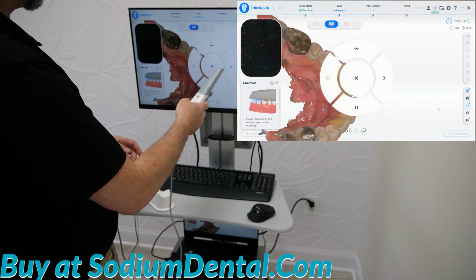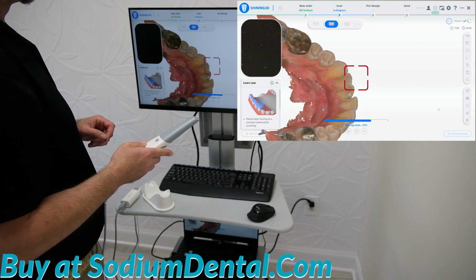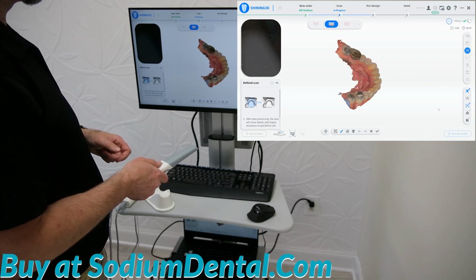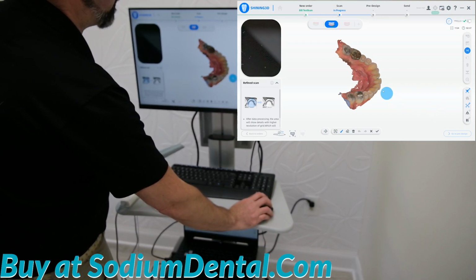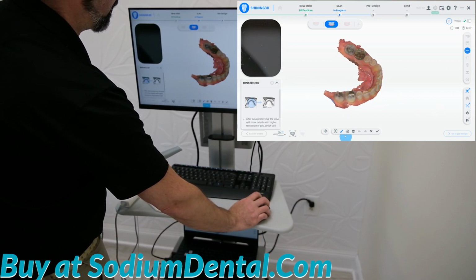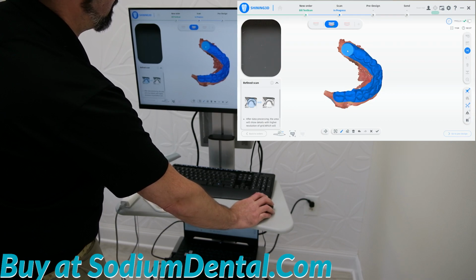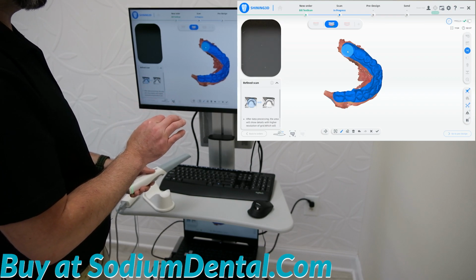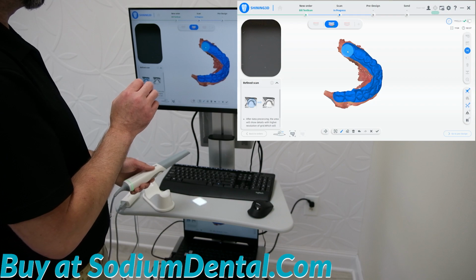Scanning is complete. I double click and wave my wand to the right to go on to the next arch. At this point, if we intend to use this scan for images later on, you can paint the teeth to store them in ultra high resolution. This is only a visual aspect. You do not have to do this to affect the quality of the impression that you're sending to the lab. This simply increases the quality of the visual of the impression.